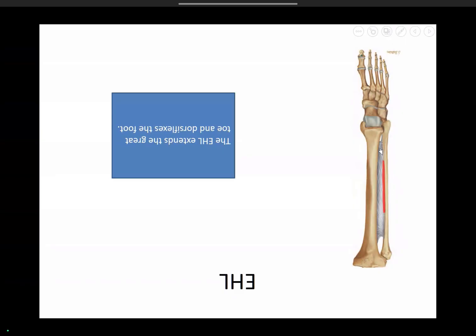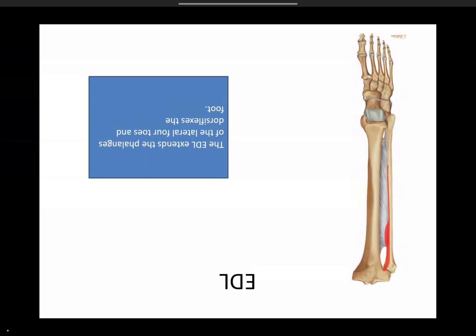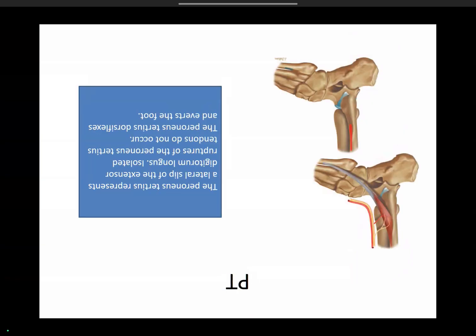Extensor hallucis longus — hallucis is the big toe — inserts at the base of the distal phalanx, originating from the middle one-third of the fibula and interosseous membrane. Extensor digitorum longus has an extensive origin up to the proximal tibia and fibula and interosseous membrane, divides into four slips, and inserts over the middle and distal phalanx bases of the second to fifth toes. Peroneus tertius represents the lateral slip of extensor digitorum longus; isolated ruptures are uncommon.